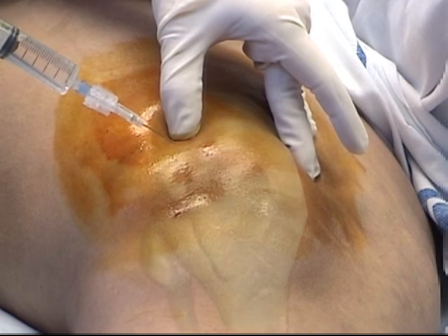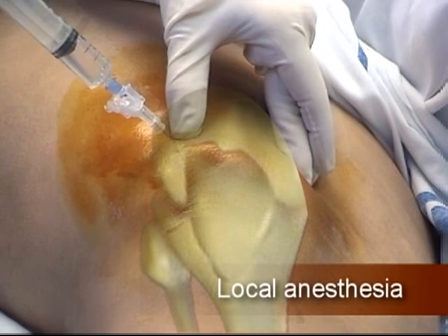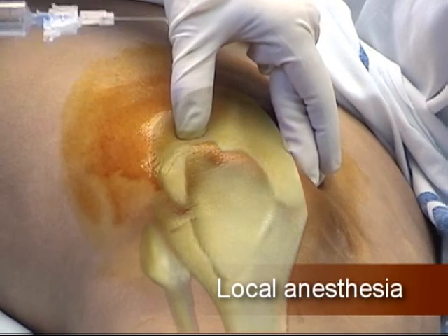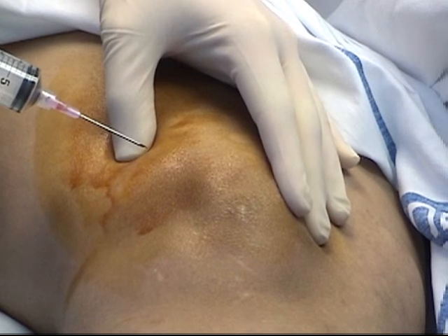Carefully clean the skin with an antiseptic solution. In this patient, local anesthetic was injected along the planned trajectory of the arthrocentesis to reduce the pain of passing the 18-gauge needle through the joint sac.